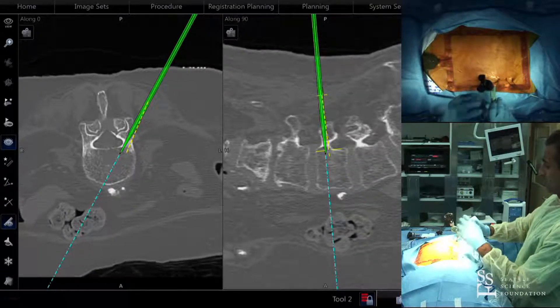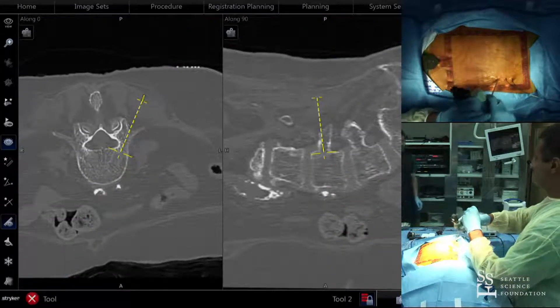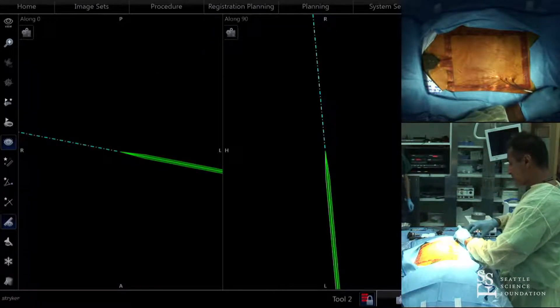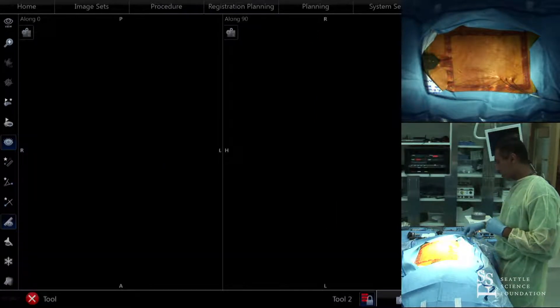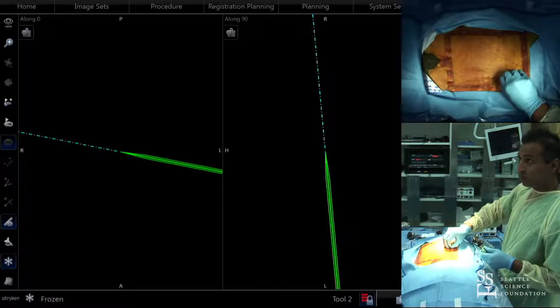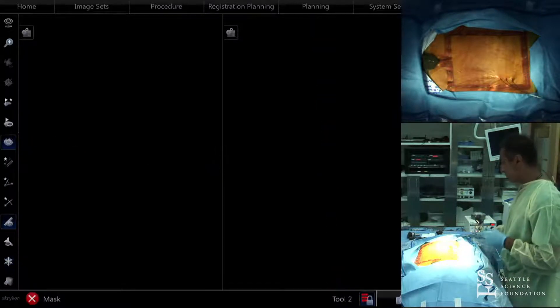Regarding guide wire depth: my goal is to see the Jamshidi enter the posterior aspect of the vertebral body, and then I put the guide wire in just enough so it's captured — if I pull on the guide wire, I just don't want it to pop out. Once I feel it has a bite, I stop.